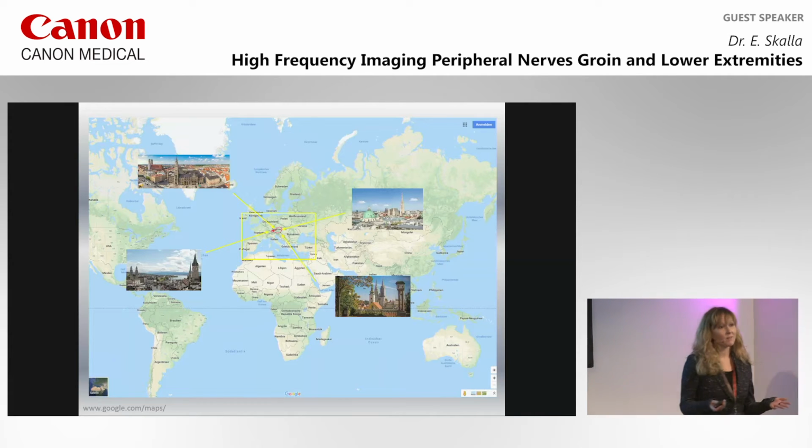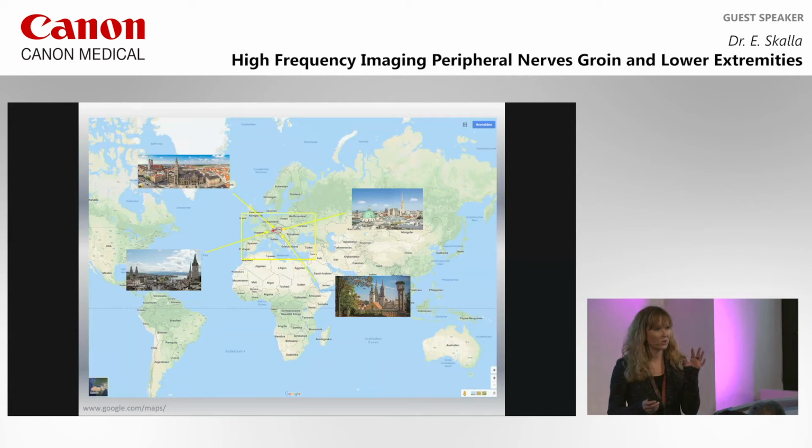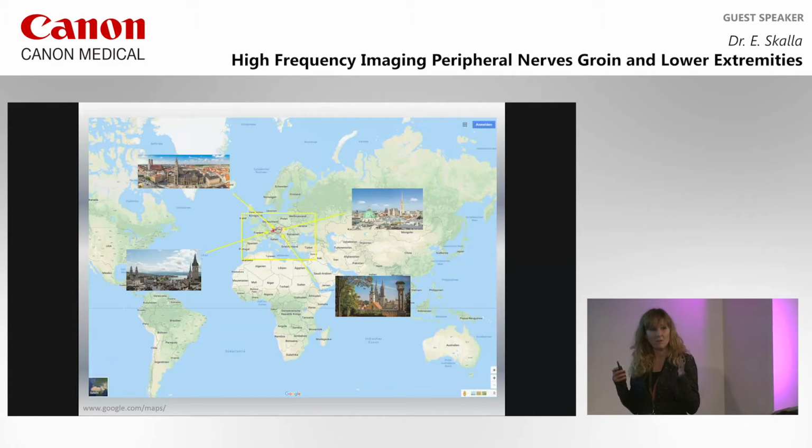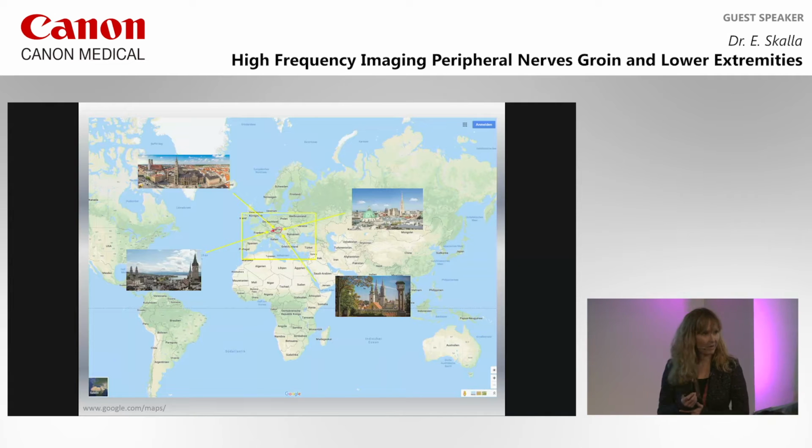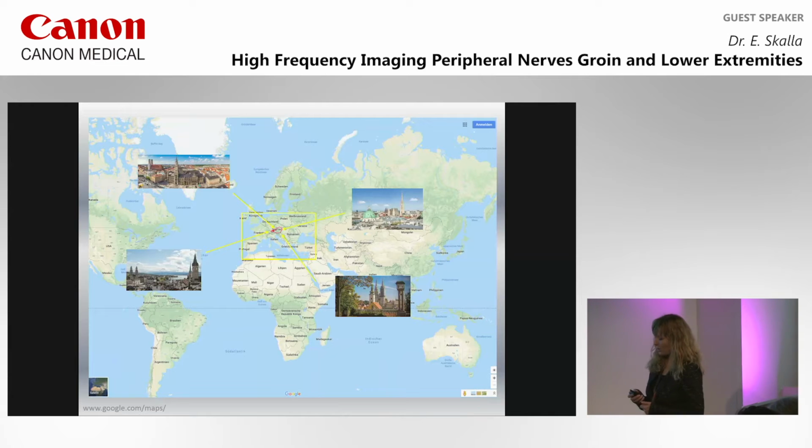So this is the same in nerve sonography, in the peripheral nerve sonography. When we want to see tiny nerves in our body, we have to know where to look, and we have to know the landmarks, which help us to find the nerve we want to see.